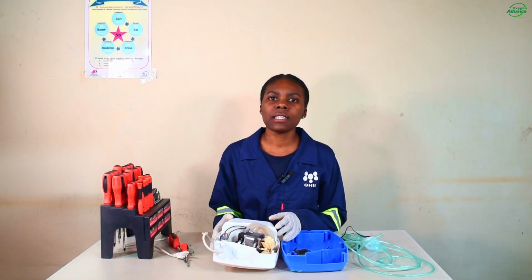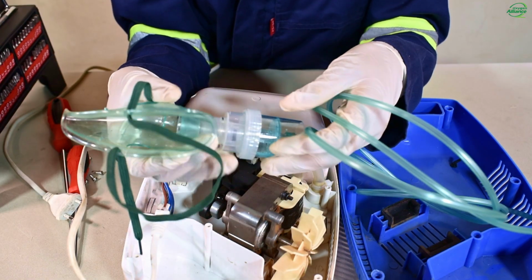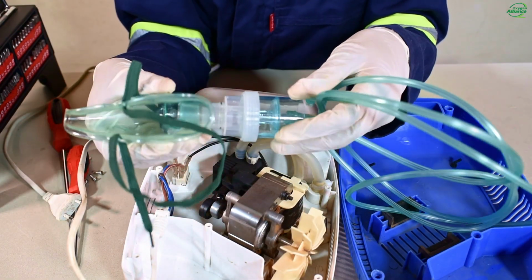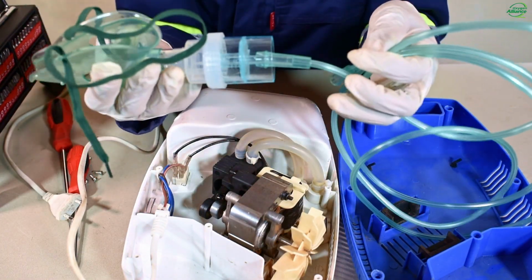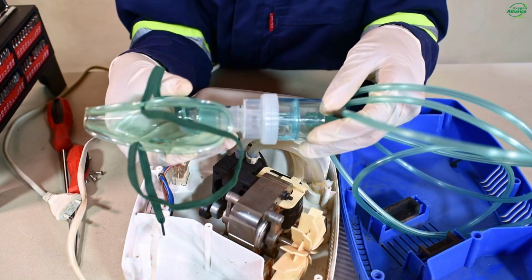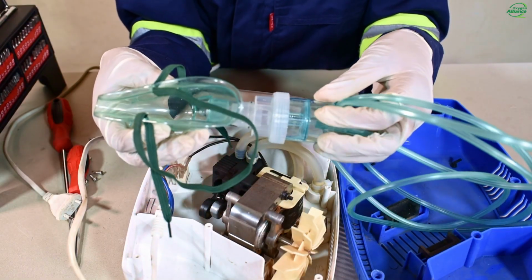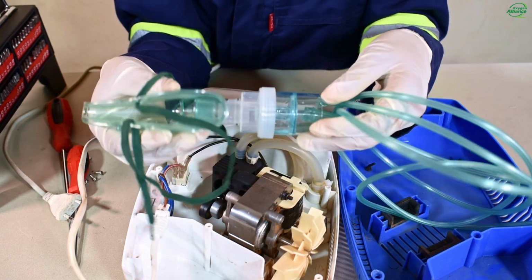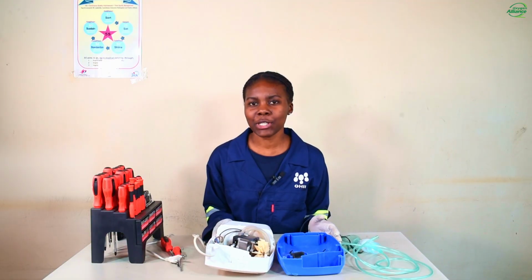Another common cause is incorrect alignment of the nebulizer kit components. The nebulizer kit components, such as the nebulizer cap and the baffle, may not be aligned correctly. Some nebulizer kits, for example this one, will only involve the assembly of the nebulizer cap and the mouthpiece, while others have a separate baffle and nozzle, and those require careful connections. Please make sure that these special connections are referred to the specific manual. With that, I have covered 4 common causes of no mist production from your nebulizers.